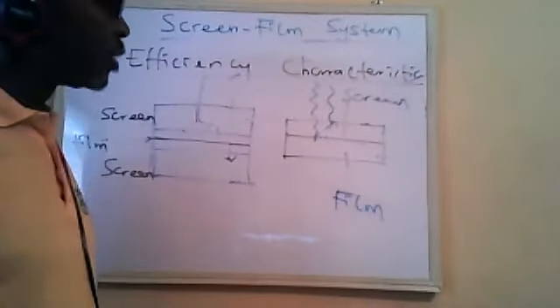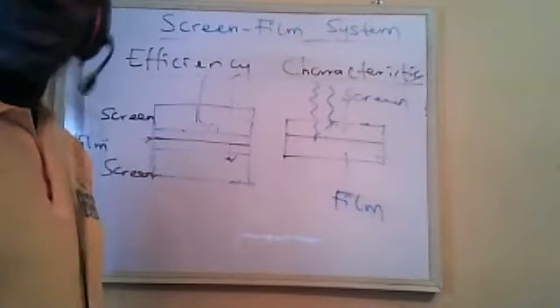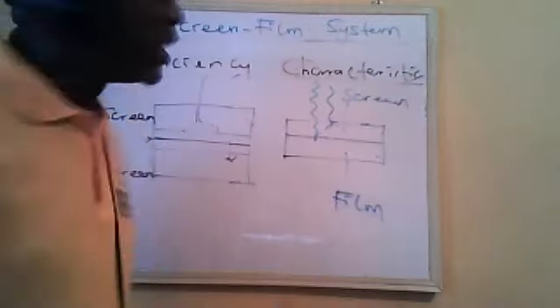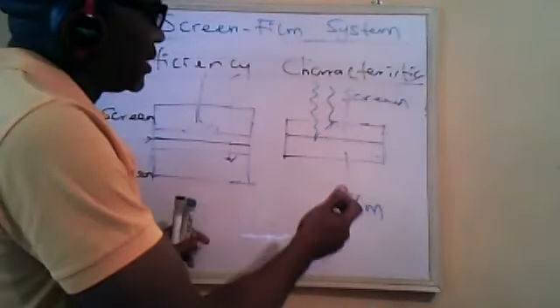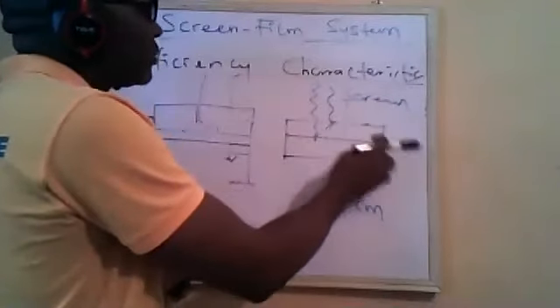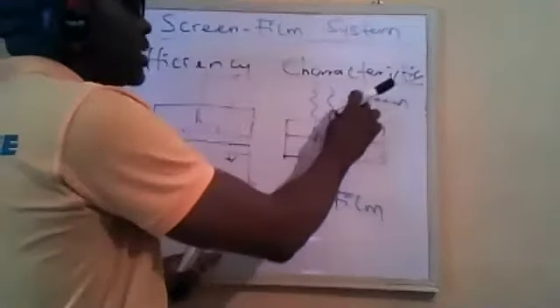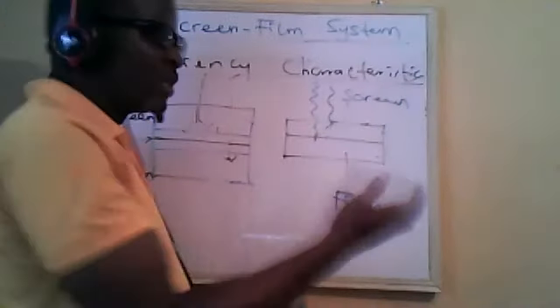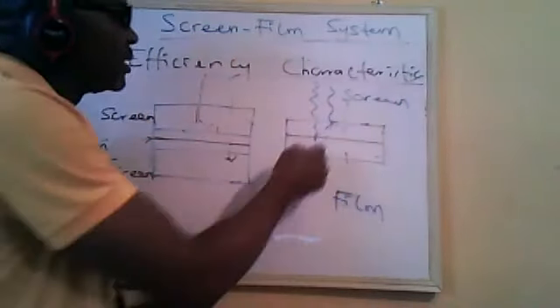I was explaining. I don't know whether you got the explanation I was trying to put forward. I said if we have the screen this way, the screen is meant to be this way to prevent the natural dispersion of the light.